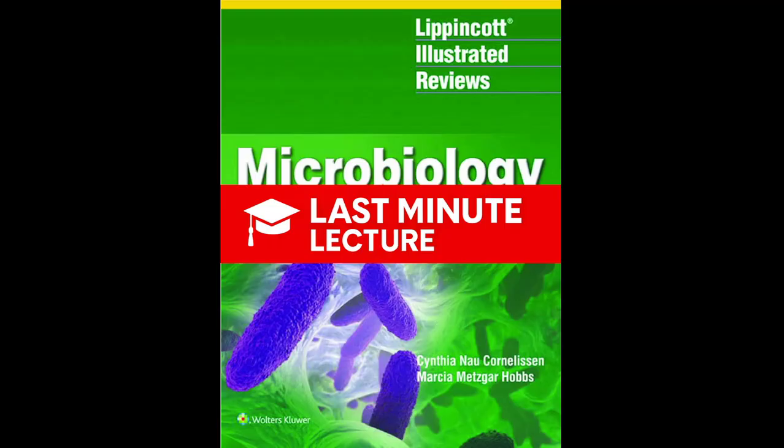Okay, so we've got our leads. Now we need hard evidence. Let's go to the lab. First up, direct visualization. Just looking at the thing. Microscopy. The biggest advantage is speed. A culture can take days. A microscope gives you an answer in minutes.